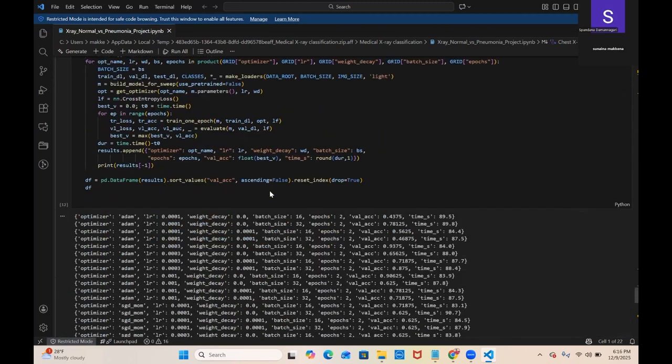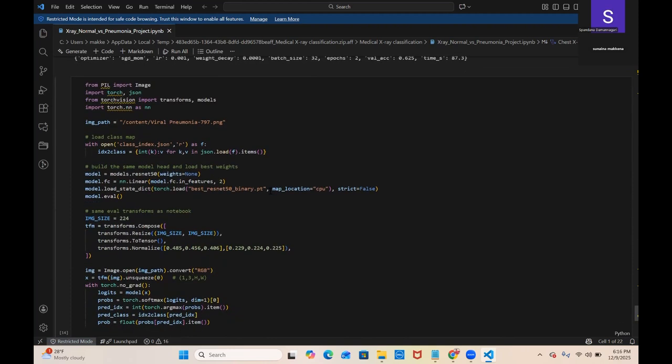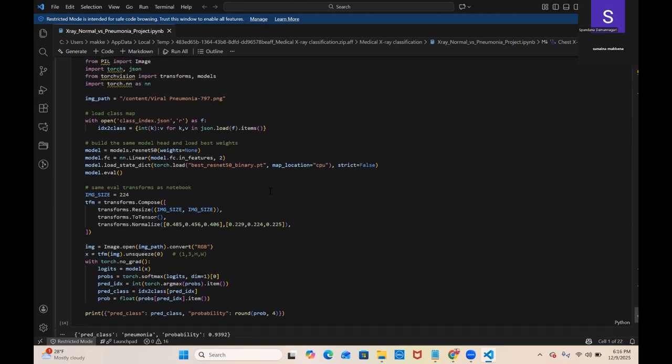Overall, these 10 blocks together form a complete and well-structured deep learning pipeline, from the data setup and pre-processing through transfer learning and fine-tuning, and all the way to evaluation, explainability, and basic hyperparameter tuning.